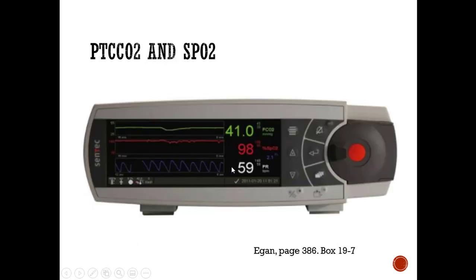This is an example of a transcutaneous monitor in a way that you would see it, obviously not the inner workings. A transcutaneous monitor has a membrane that sticks onto the skin. Generally speaking, we use this with premature babies. It has a warming mechanism on the membrane that will warm the skin to bring blood flow to the surface, and it will analyze the CO2, the SpO2, and the heart rate.